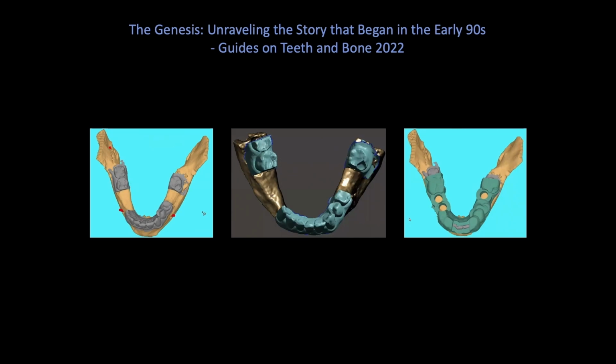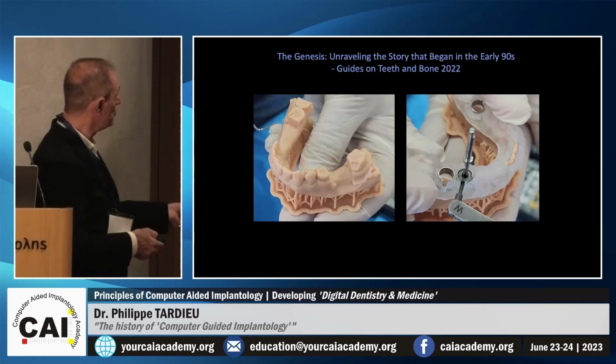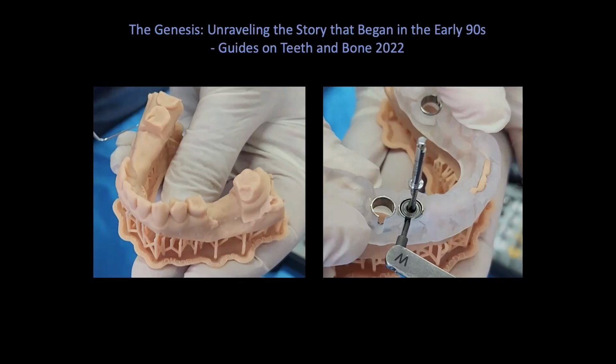In this way, we remove that, and we overlay over this, and we make a surgical guide. So now we have the opportunity to see the teeth, the bone, and the mucosa. It will allow you to have a direct access to the bone, in cases you want to do it, with a perfect fit of your guide.